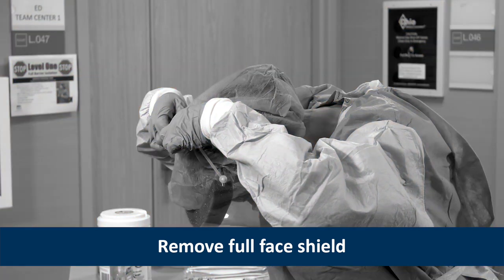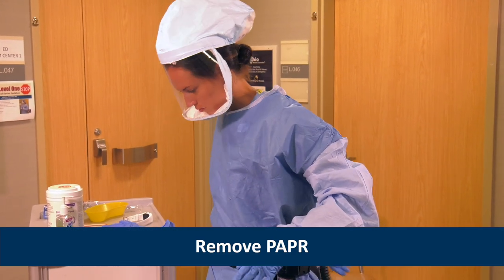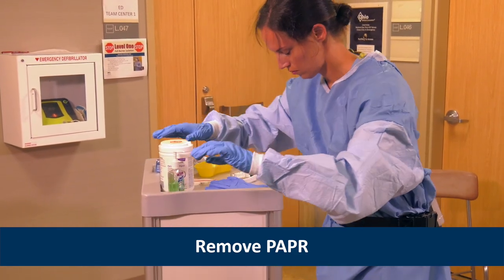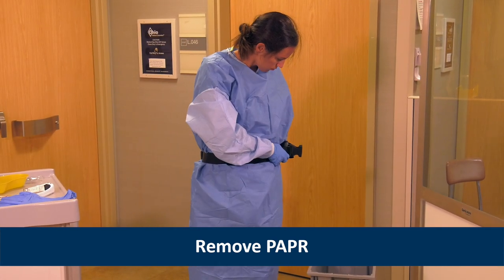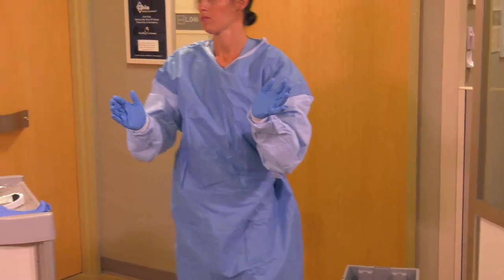She tilts her head slightly forward, grasps the rear strap, and pulls it gently over her head, allowing it to fall forward. If Heather was wearing a PAPR with an external, belt-mounted blower instead of a respirator and face shield, she would remove it at this time by first removing the PAPR tubing from the hood. Next, Heather would remove the hood by tilting the head slightly forward and allowing the hood to fall forward. Then, she would unfasten the PAPR belt and place the reusable components into a container for cleaning. If she was wearing a PAPR with a self-contained blower in the helmet, Heather would wait until the end of doffing to remove it.